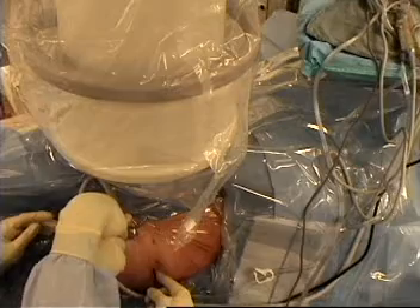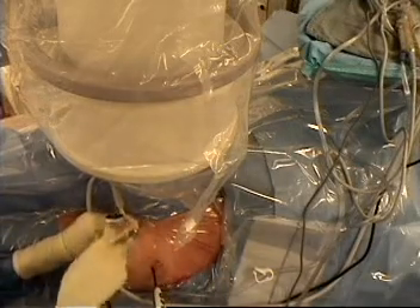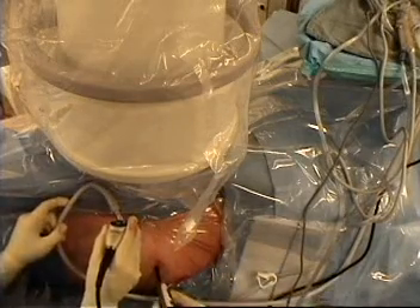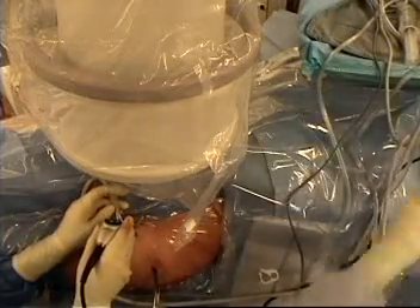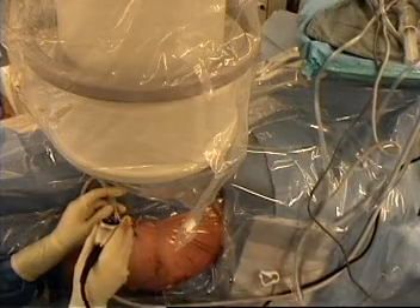I think we need to do the whole thing actually, just because you are starting to get a little bit of a wave sign. Because when you get a wave sign it means it is actually going quite far. So what we are going to do is cut this off with a shaver and cut out the capsule so we can see.